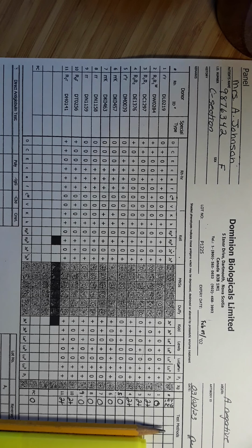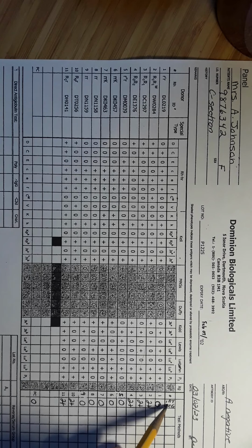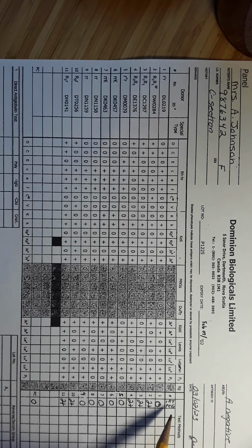So you can see at the top of the column here that it says IAT PEG, and a panel is always done in the same phase as the screen. So if a screen is done by IAT PEG, the panel is done IAT PEG. You don't suddenly switch to doing, let's say, a room temperature panel or a panel that uses a different enhancement agent. You use the same process.